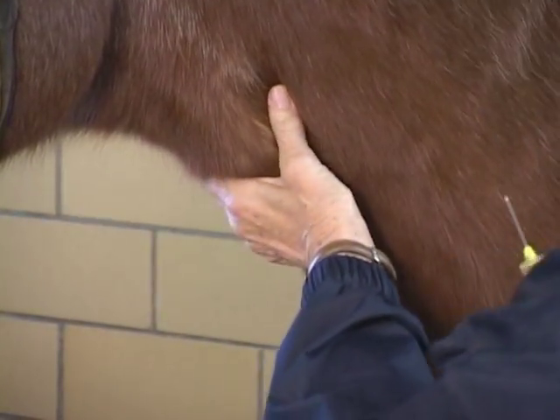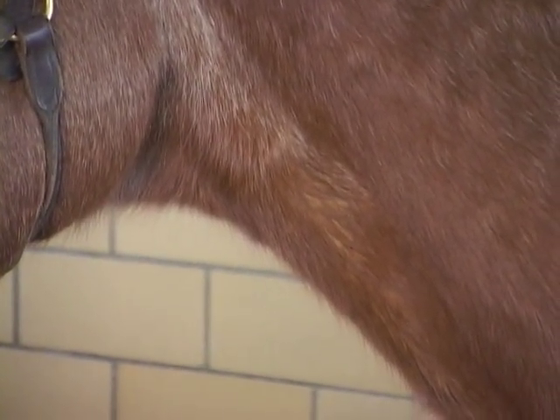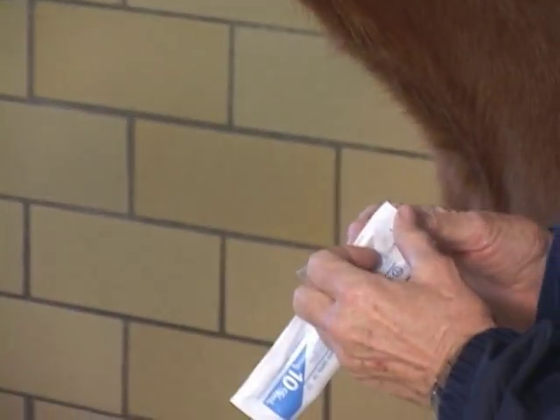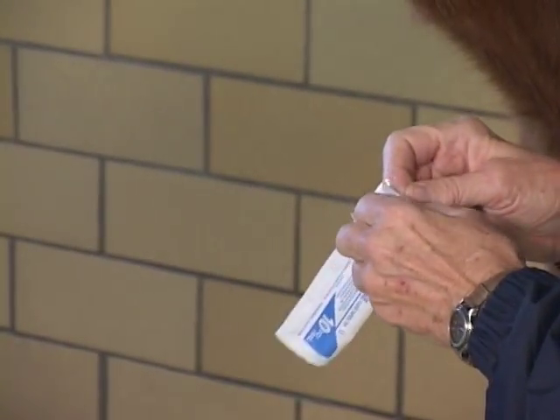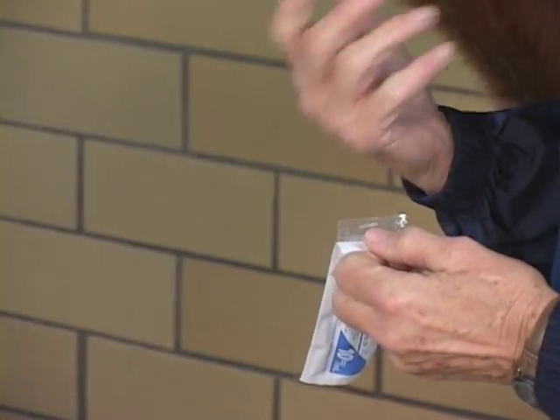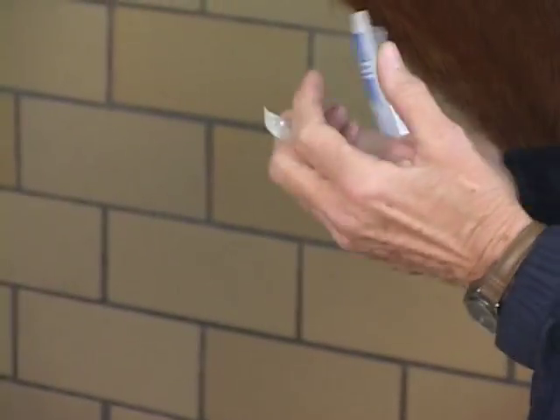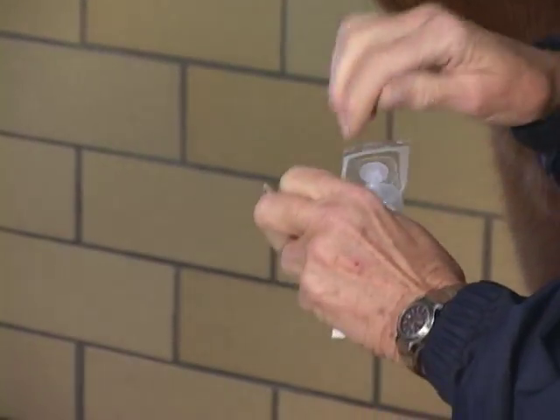When you go to take it out — there you go. My job from a restraint point of view, of course, is to try and persuade Red to stay still. He's a real pro so he stands here nicely, but your client horses may not do it quite so well. You need to be prepared for them to move and know where you're going to move if they do. I'm going to show you the syringe and needle technique, because a lot of times when a horse is moving around, it's actually easier to draw blood with a syringe and needle than to manipulate the vacutainer and risk losing the vacuum.